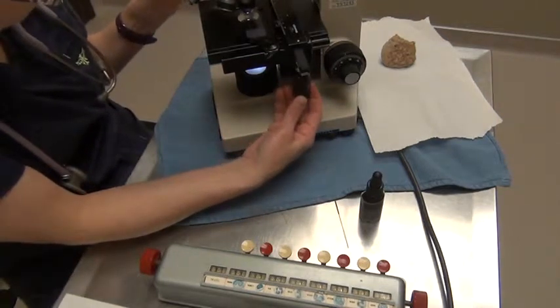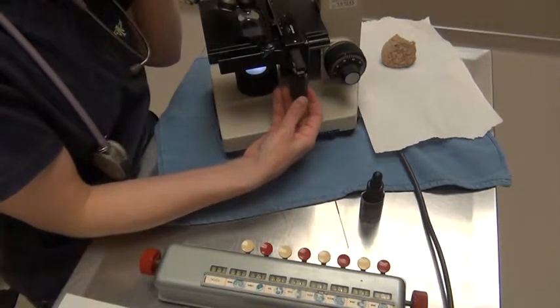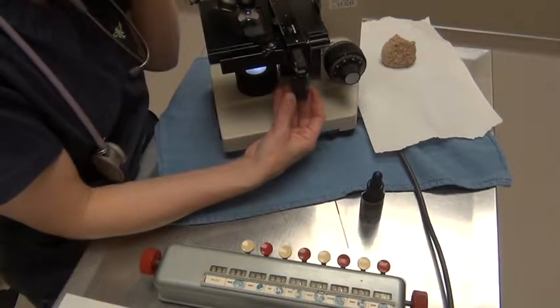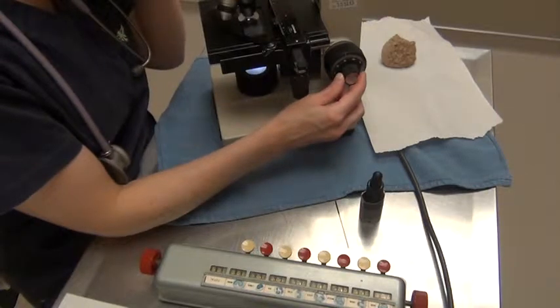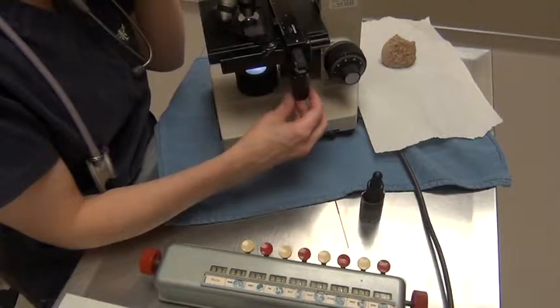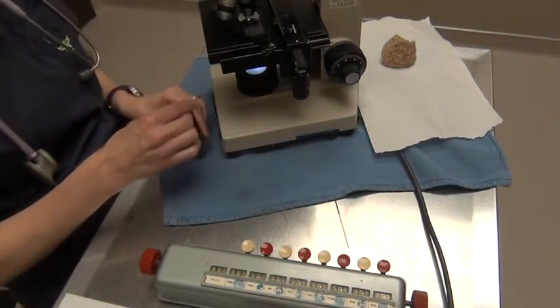So before we do our counts, as far as where you need to stop and perform them, come out to the edge of the feathered edge, and you're going to work your way backwards. So when you come out and you start seeing all that streaking, you need to stop and go back just a little bit. Okay, so I'm going to go up to 40 now and look around. Of course, the cells are much bigger, and you can see architecture, and you can see white cells at this stage, but we're going to actually do our count on 100 power with immersion oil.